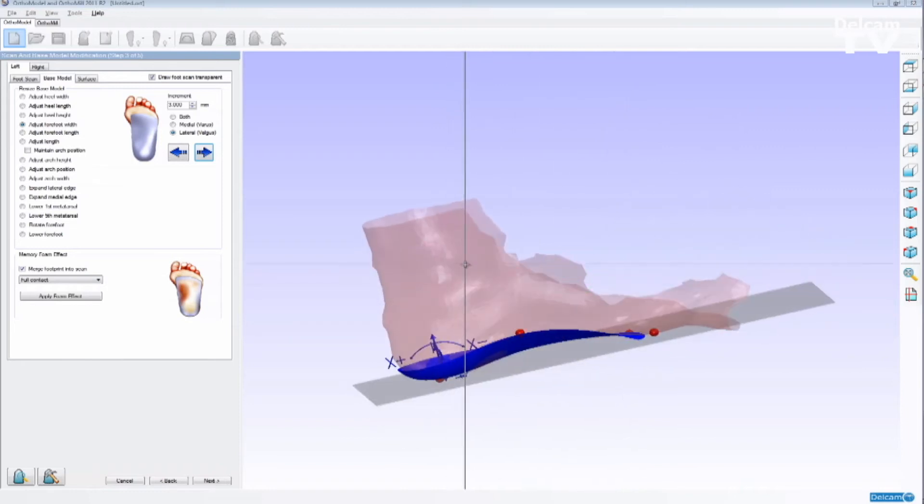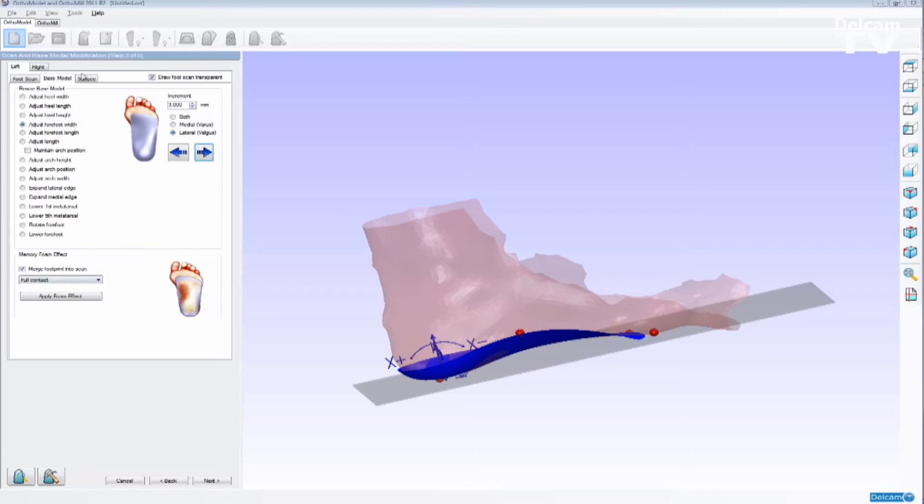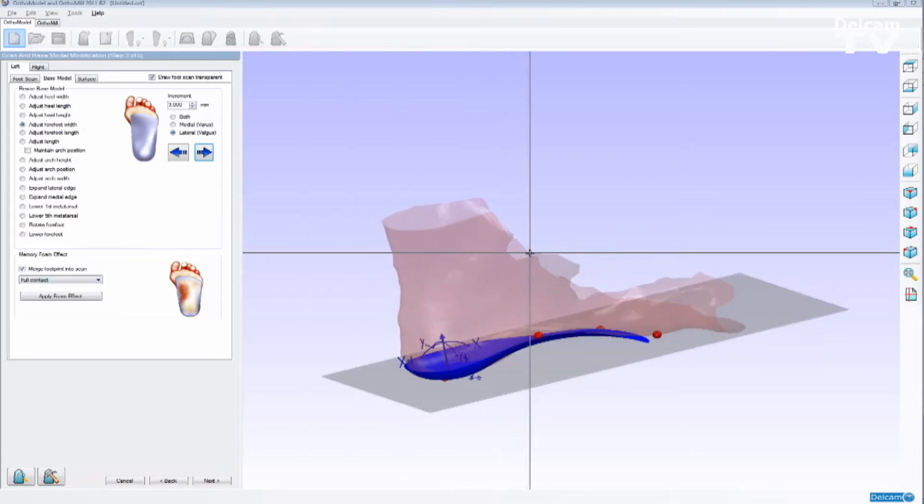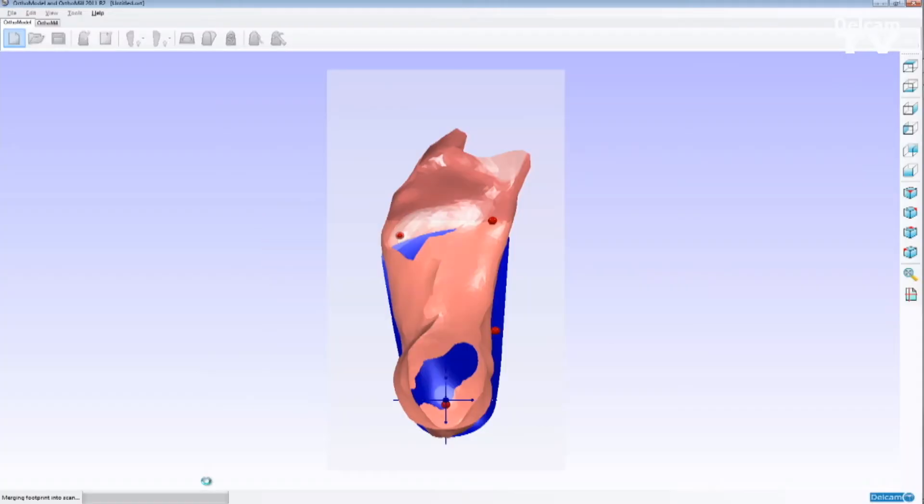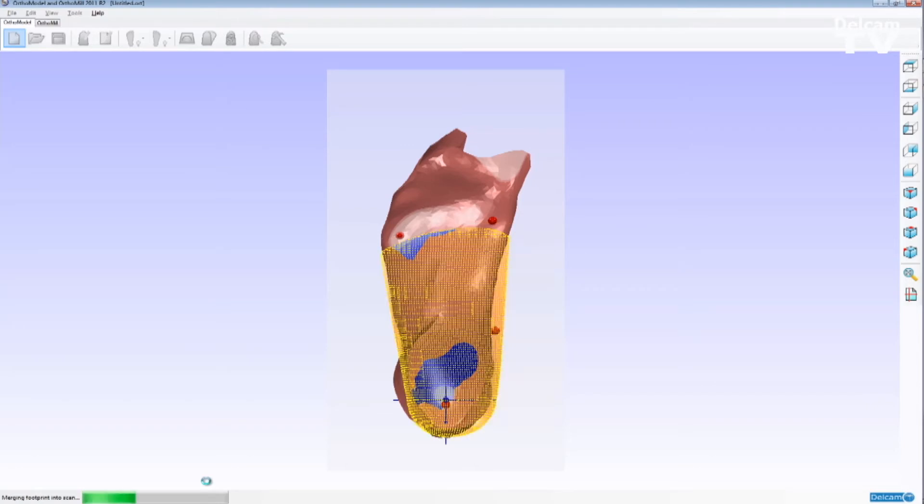Modifications like adjusting the arch height, and etc., are also available on the list on the left-hand side. But one of the most important options that we have is the memory foam effect. It's how the orthotic is going to touch the patient's foot. And we have five options that we can use, which allows us to design an EVA orthotic which matches the patient's foot exactly.